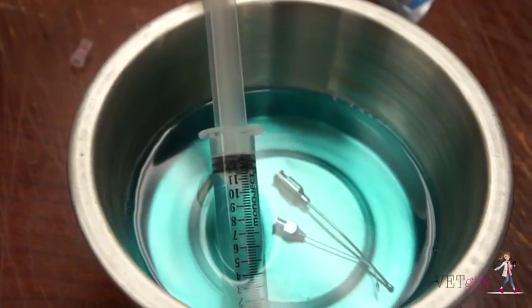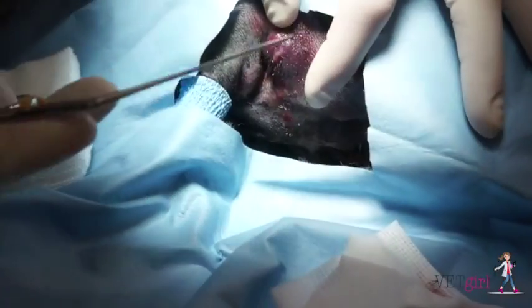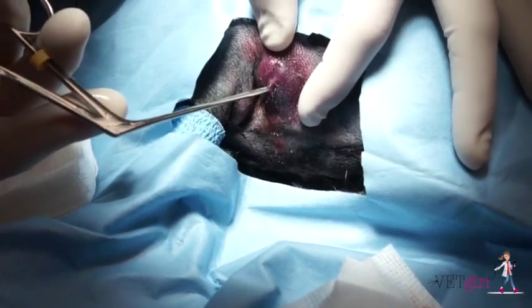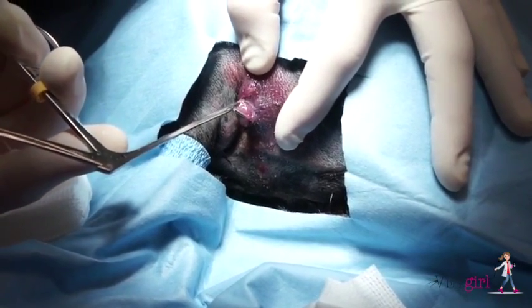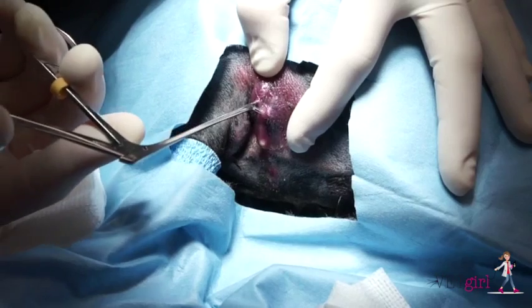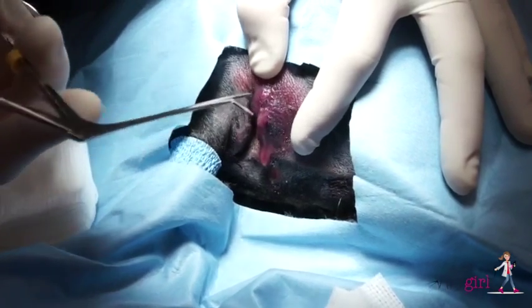Using your sedative of choice — we like hydromorphone and diazepam personally — we clipped a large area around the perineal region, wrapping the tail to help keep it clean, and gently scrub the affected area.